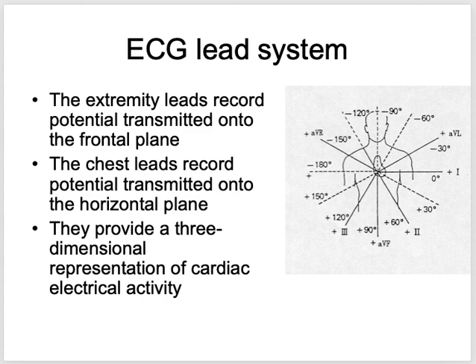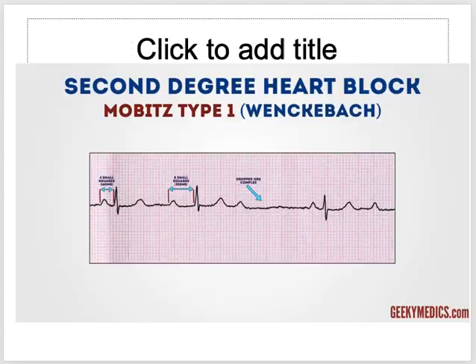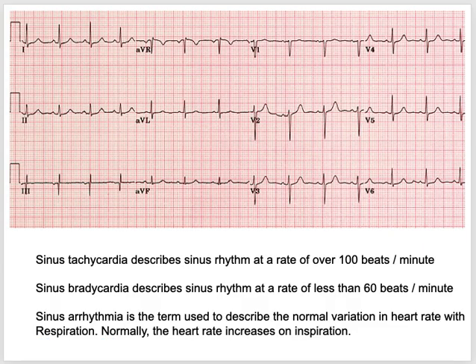So simply guys, remember this, if you understand this concept: if I find that lead 1 is upgoing and lead 2 is upgoing, it means that the axis is normal.